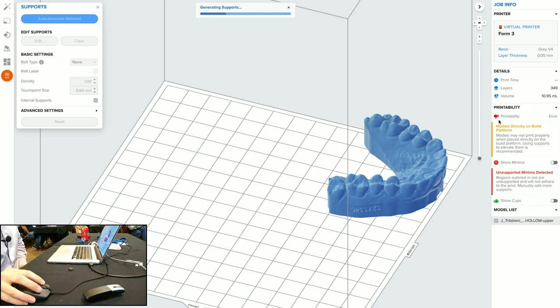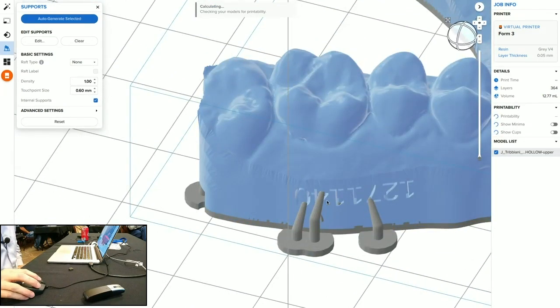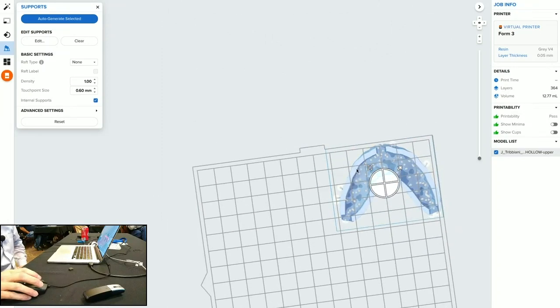And you see it's giving me a thumbs down on printability: models built directly on platform. That's because I haven't given it supports yet, which is doing it right now. So it's going in there and analyzing all the parts that it thinks will fall without support and sticking a support on there. You can see on my name here, or the number, part of that 7 would fall off without a support to hold it in place till it gets the top layers on top. You can flip it over and you can see all the supports.